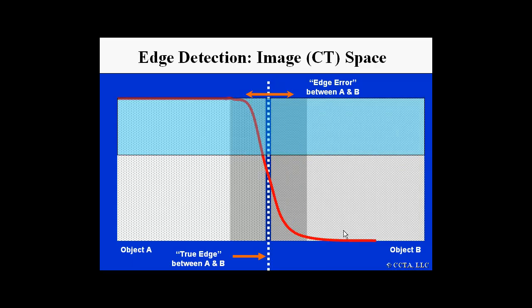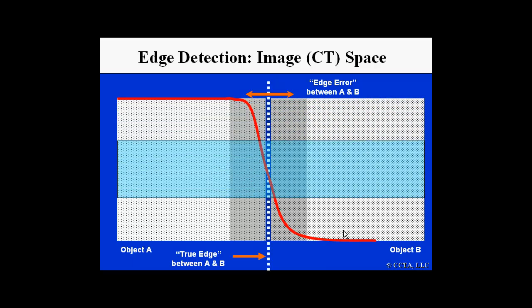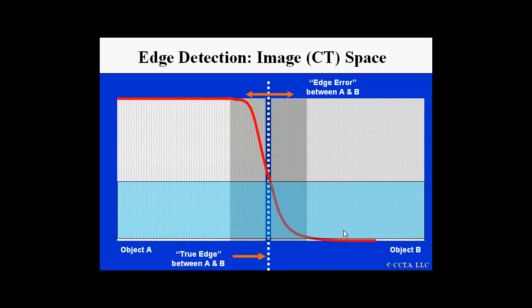When we present our information in terms of displaying the images, we frequently do not display the entire range of CT numbers possible, but cone this down to a particular CT level and a particular viewing width, or CT width.